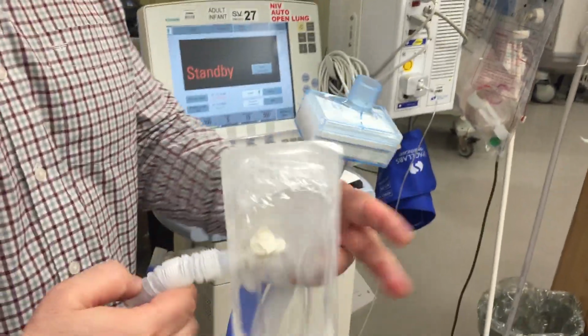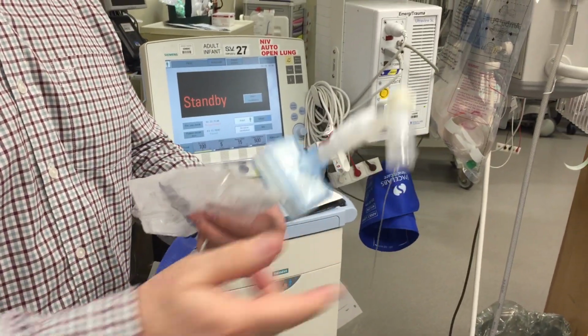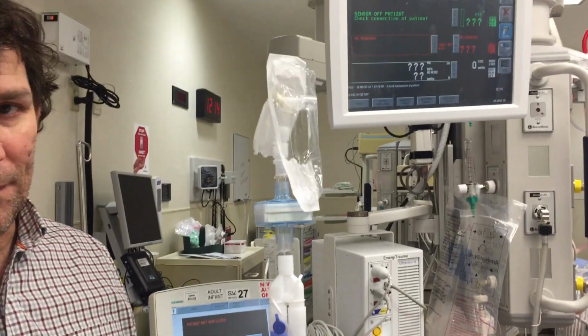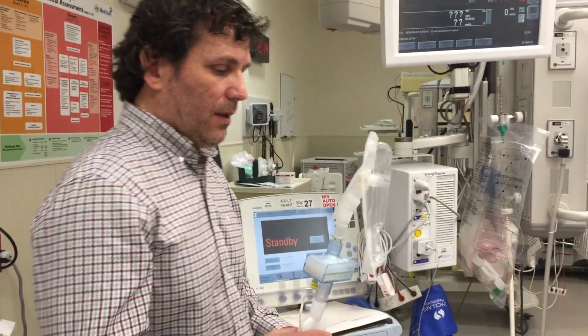The other part of it is our swivel, which is the one that actually connects to the endotracheal tube, and that's how we're going to connect the ventilator to the tube. So this is essentially what it should look like as a whole when you come in. All three pieces should be already assembled. You shouldn't even have to worry about it.